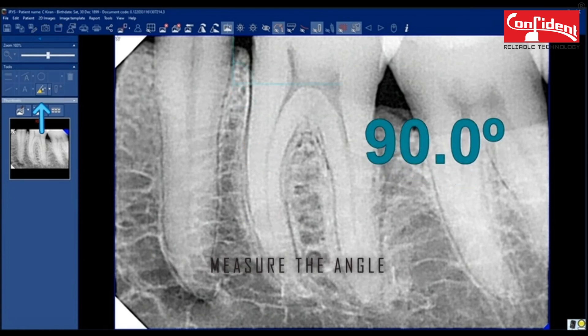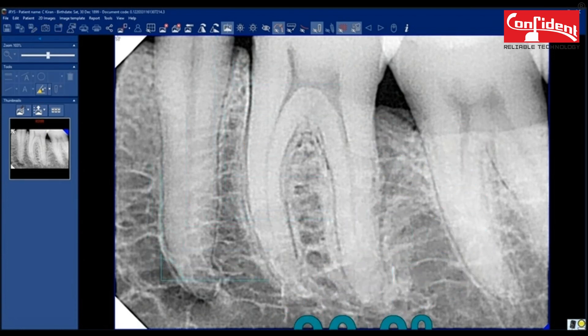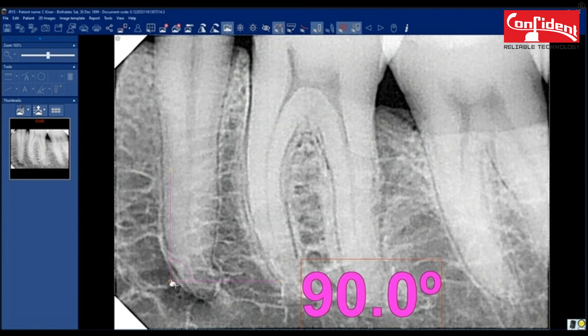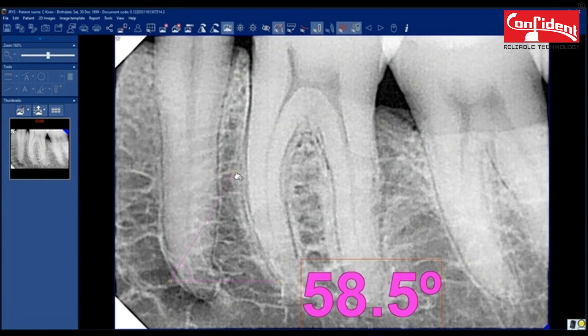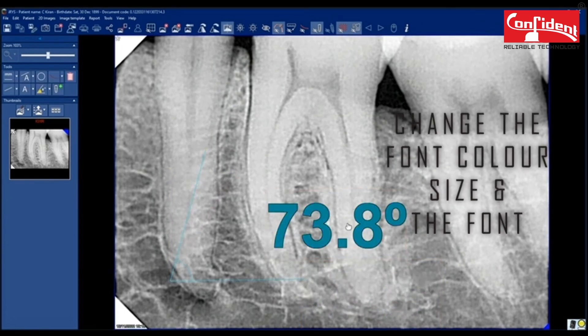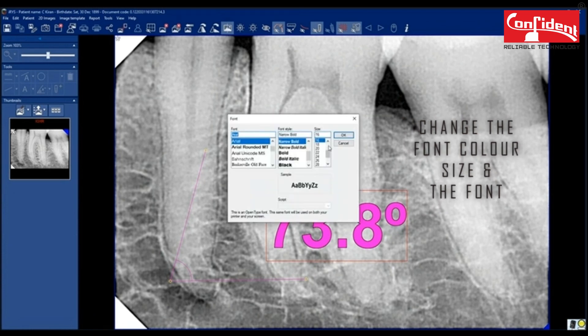Measure the angle using this tool. Place the anchor point anywhere in the image and adjust both the lines for a desired angle. Font size, color and the font can be changed.